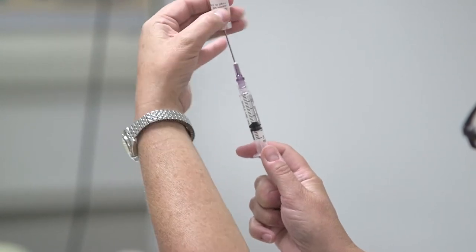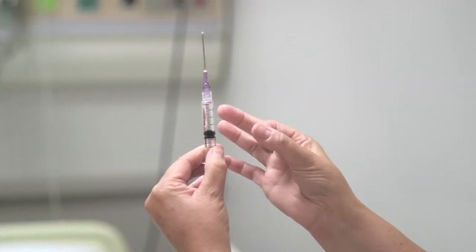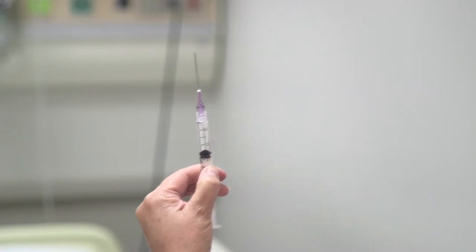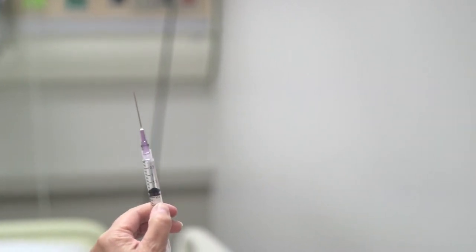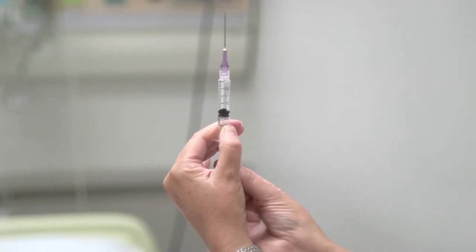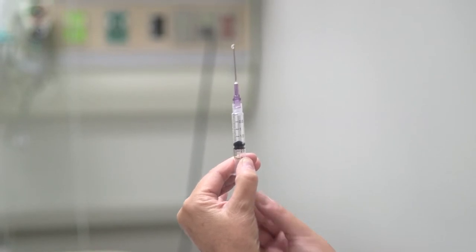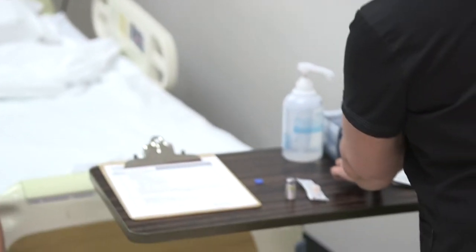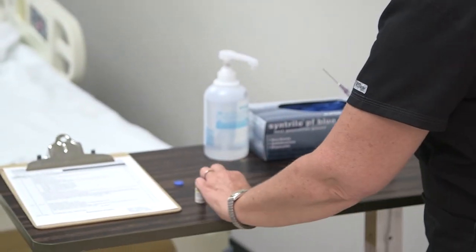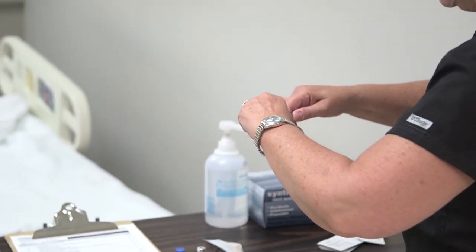All right, so once we do that, again, this is not a sharps, but still something you don't want to come in contact with your skin. All right, so now I have my fluid in there, but I want to make sure I have the 2 mL, which I am right at that 2 mL mark. All right, so then even though this is blunt, you want to safely put the cap on this, and you're going to remove that cap.